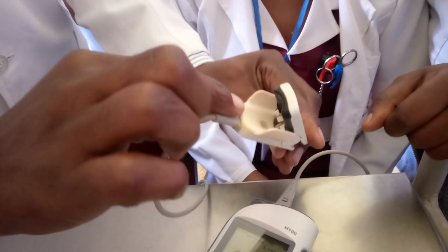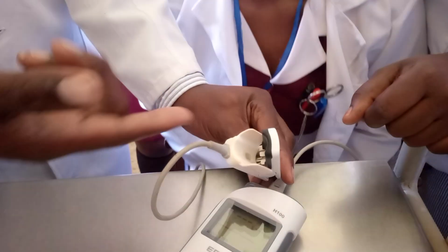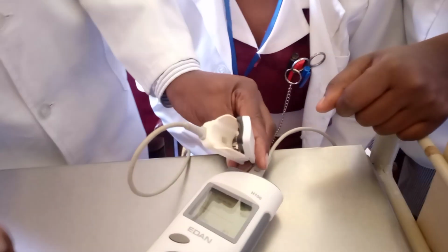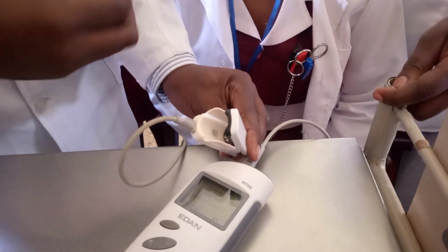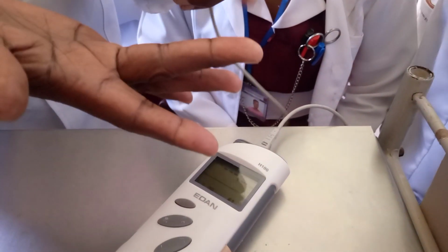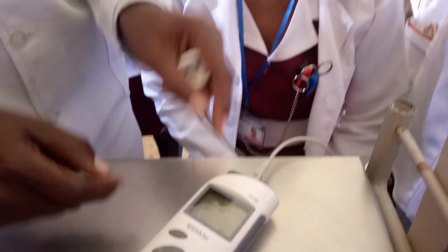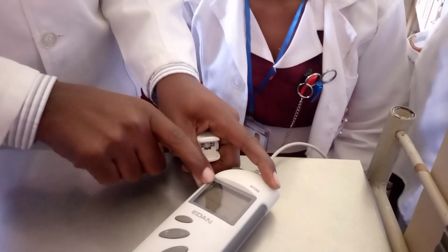When you look at this, it's blinking there with something red. That's what we call infrared. It's more like rays, like the ultraviolet rays we have, but this one is infrared. Infrared is what we use to get the readings here. The infrared is going to penetrate through somebody's tissues. Once it penetrates through the tissue, it will be able to get the readings, which are oxygen saturation, or SpO2, and pulse rate.